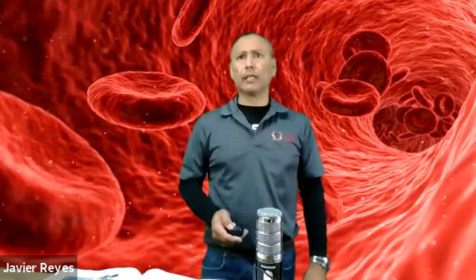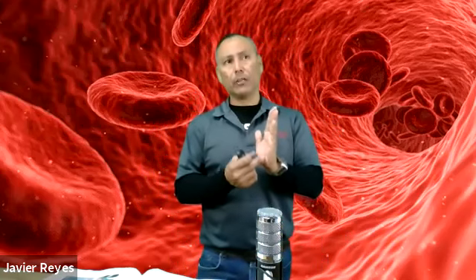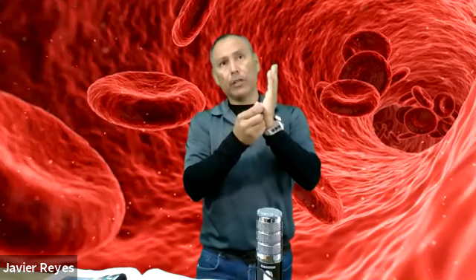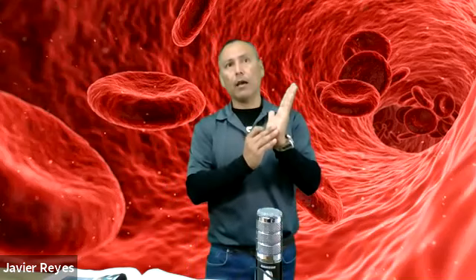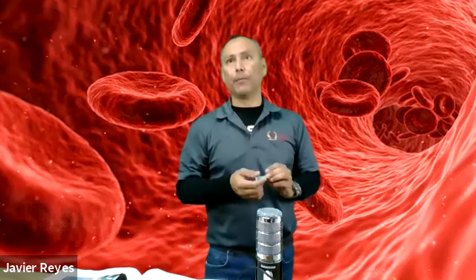So, correct selection of the puncture site. Again, make sure you select it correctly. After reading step 6, confirm that you know how to select a safe site. Why do you not want to go more than 2 millimeters deep? Because as you go deeper into the skin, maybe by depressing the lancet too hard, the deeper you go, the less blood flow you're going to get. Remember, most of the capillary beds are right below the surface of the skin. So that's where you want to puncture, and not go below that.